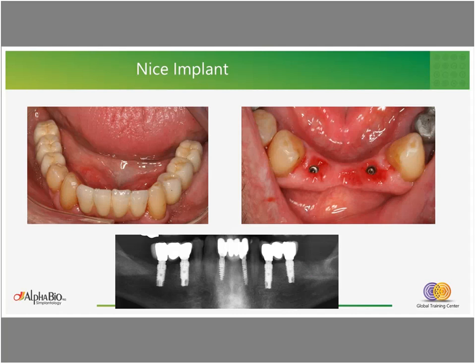This will also contribute to the integrity of the bone of the posterior area. So platform switching is an advantage, especially when we have a conical connection. And even if you use the internal hex connection, you can also select a narrower abutment profile. And this will also give us an advantage in the stability of the gingiva.